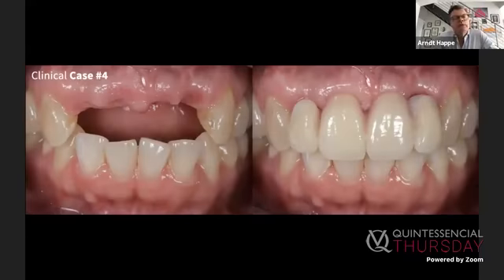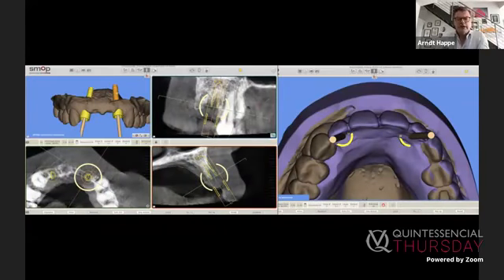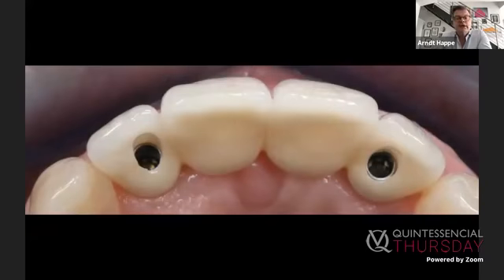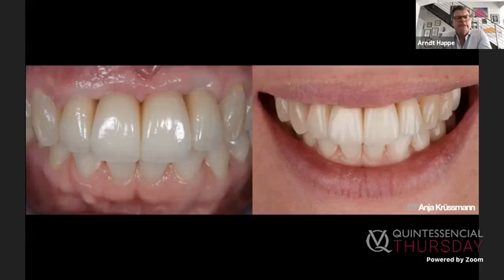So now you see this patient here with the setup, this acrylic teeth, just a setup in the mouth to give the patient an idea where we could go. And then we do again the planning, we superimpose all the information, the surface scans, and you see after the surgery, the restorative phase. And now we can fabricate a screw retained bridge. And if you take a look at the result, it looks pretty nice, but it's not perfect. Why? Because you see here the alignment of the soft tissue is not perfect because we didn't build up enough tissue vertically, because we were missing some information.